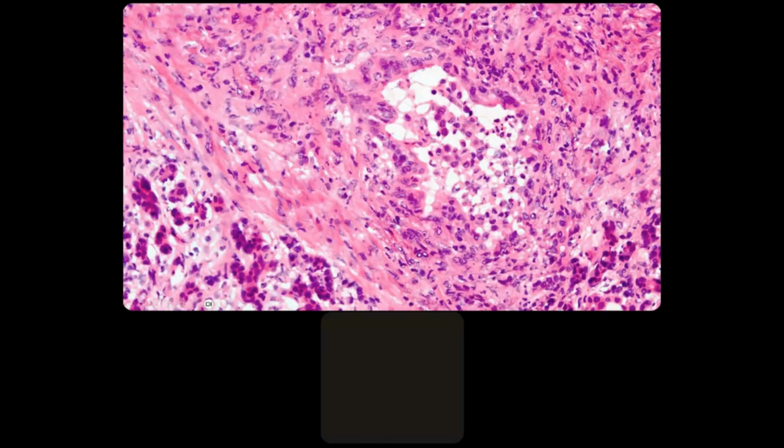And this is another example of frozen section. Bottom left here, you've got acinar tissue, and then you've got these very atypical single cells in association with the cells that look very much like it in the duct as well. So this is a slightly easier example, a bit of debris and dying cells in there.